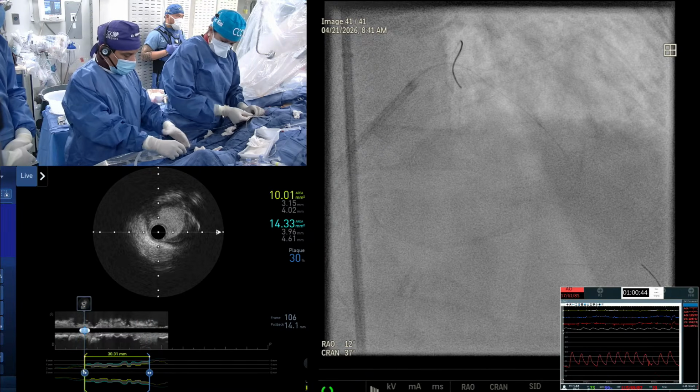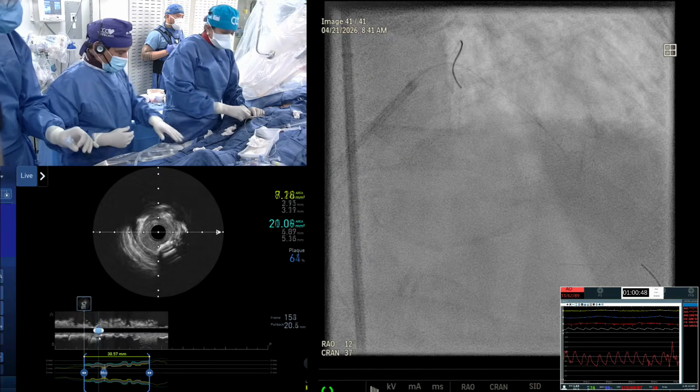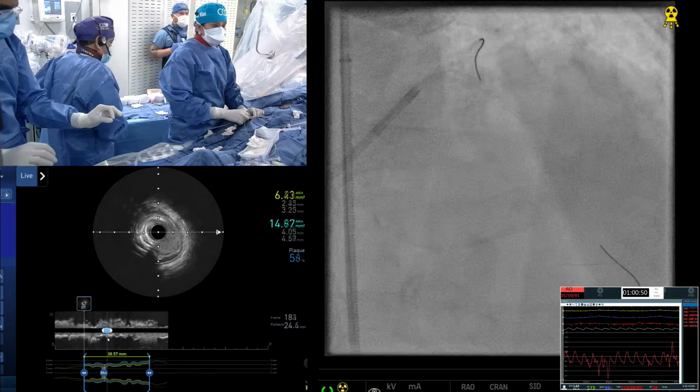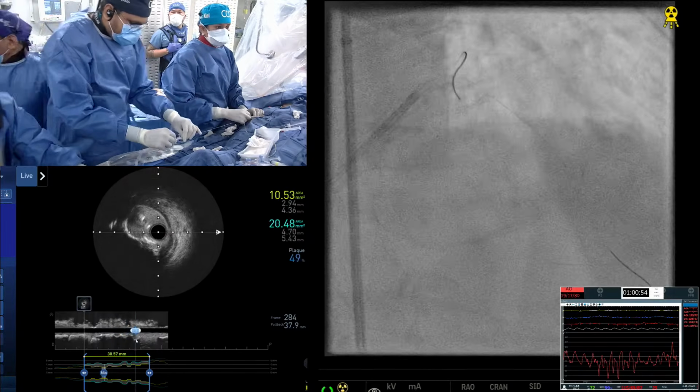Okay, let's put this, we can do that. If people want that, that's fine with me. Good. Because there's nothing weird. The majority of the decision has been made. So just the dilatation balloon. And okay, let's continue our slides.